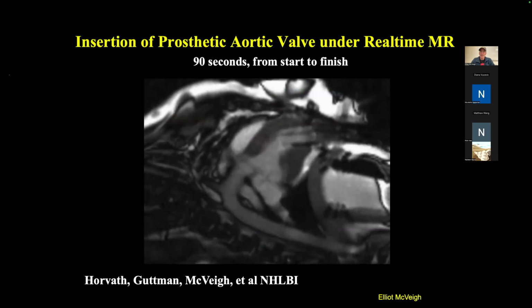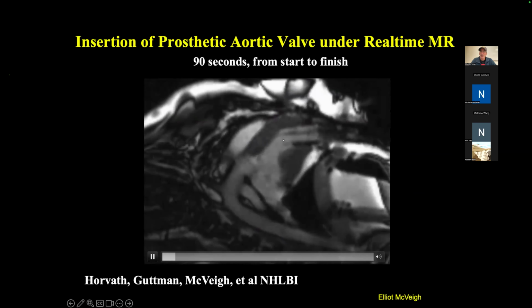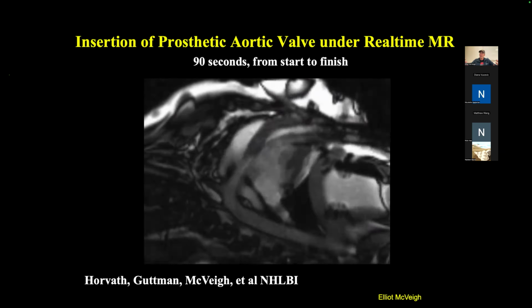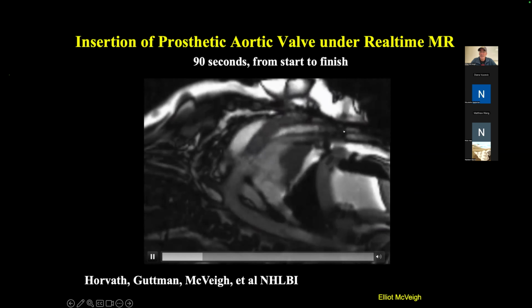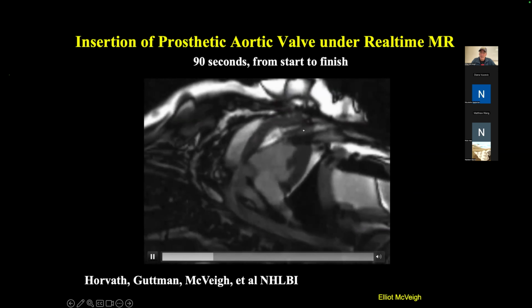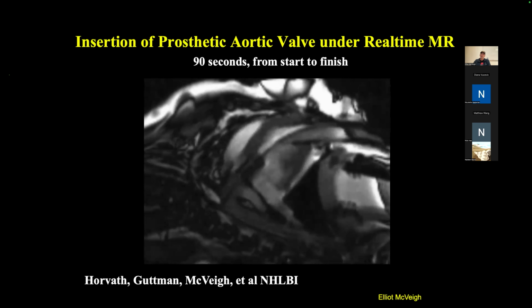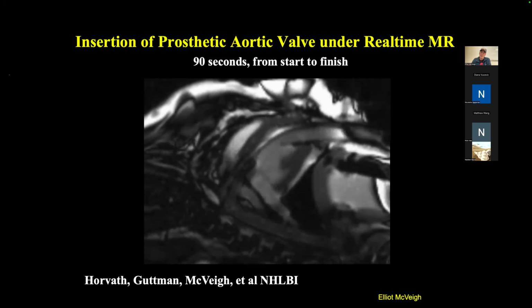And then here, this is the last heroic application I'll show you in cardiology, where we have a trocar that we have essentially inserted into the apex of this heart. This is under real-time MRI guidance. We've got the plane to where we want to see, and now we're going to take a device which happens to be an aortic valve, and push it under real-time MR guidance into the native aorta here. The clinician, a cardiac surgeon, I did this with Keith Horvath, is pushing that in and maneuvering it to get it right into the right spot.